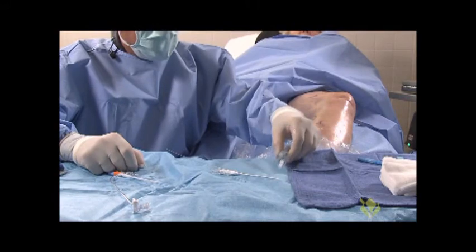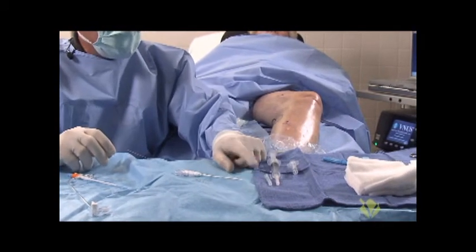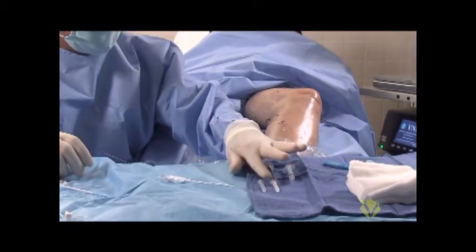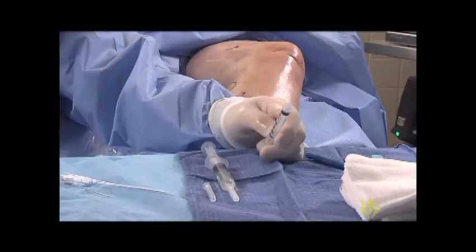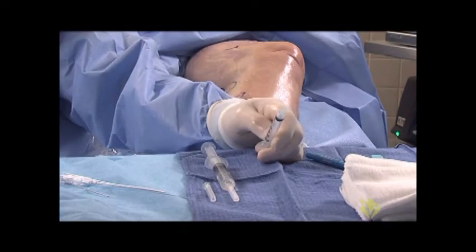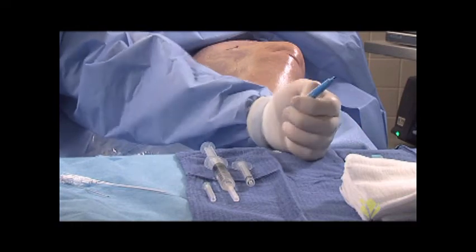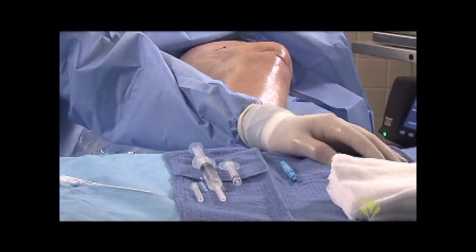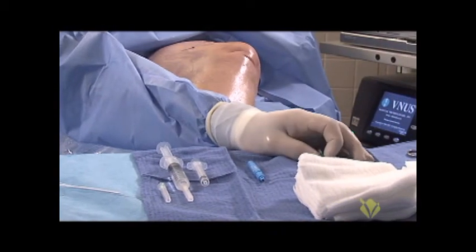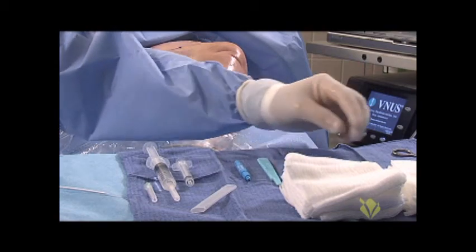What else do we have on here? We have 1% xylocaine that we've drawn up off the table with a 19 gauge needle and then a standard 27 gauge. A small 3cc syringe to help flush the catheter out and cap the sheath after it's placed to control any oozing. A little marking pen to mark the skin where you're going to put the lidocaine so you keep track of that. And a simple 11 blade knife to make your dermatotomy if needed.